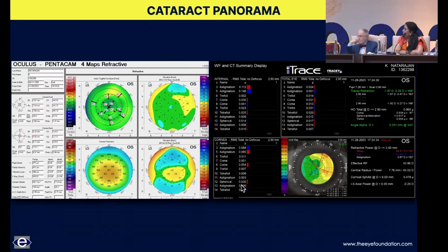What about the Odyssey? Do you think that will work better? Odyssey is the new AMO lens which is coming. Well, it has a larger landing zone. Yes, so an Odyssey might actually work better because of that. In the U.S., the Synergy has been pulled from the market and replaced completely by the Odyssey. And they can't make enough Odyssey lenses to keep up with the demand. They're selling so well. What is your preferred biometric formula in LVC patients?